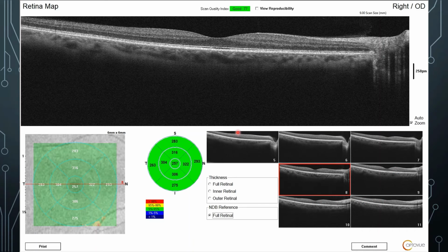And it also maps out the thickness. Now you can start measuring actual thickness of the tissue. And when it's on its side like this, you can start picking up things happening in the retina that from a frontal or top-down view of the Optos, you don't see. So this is just an amazing device.